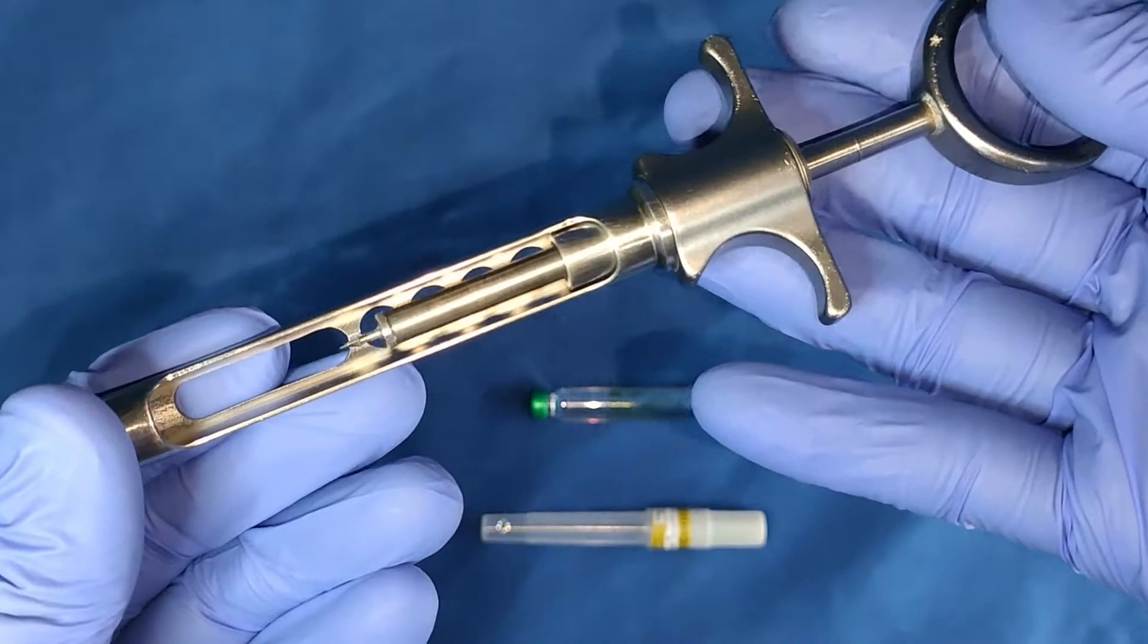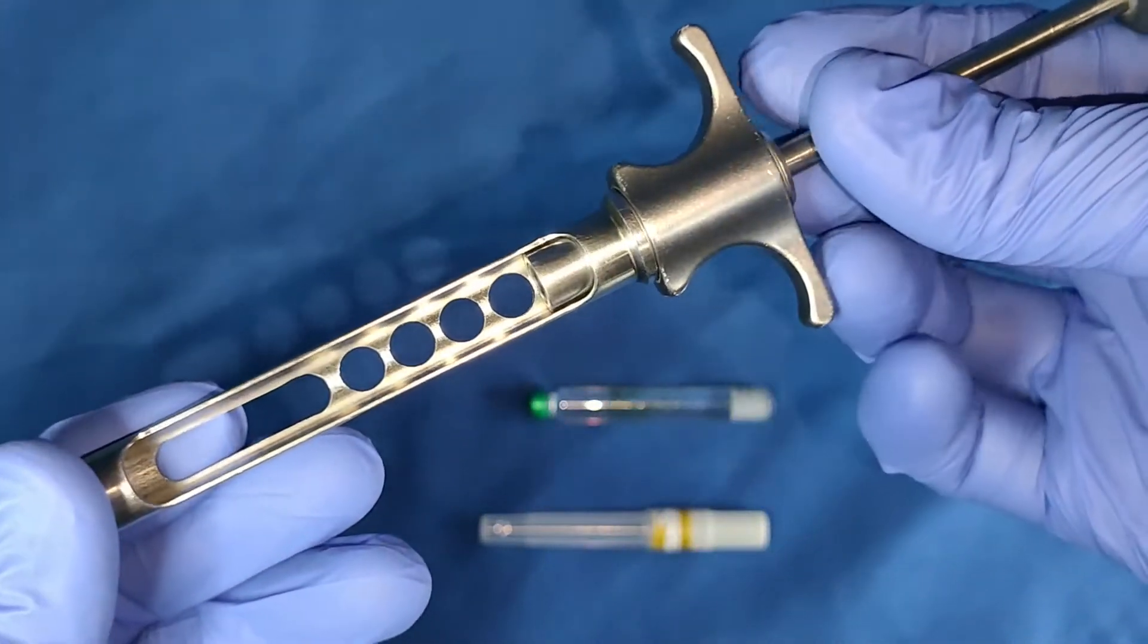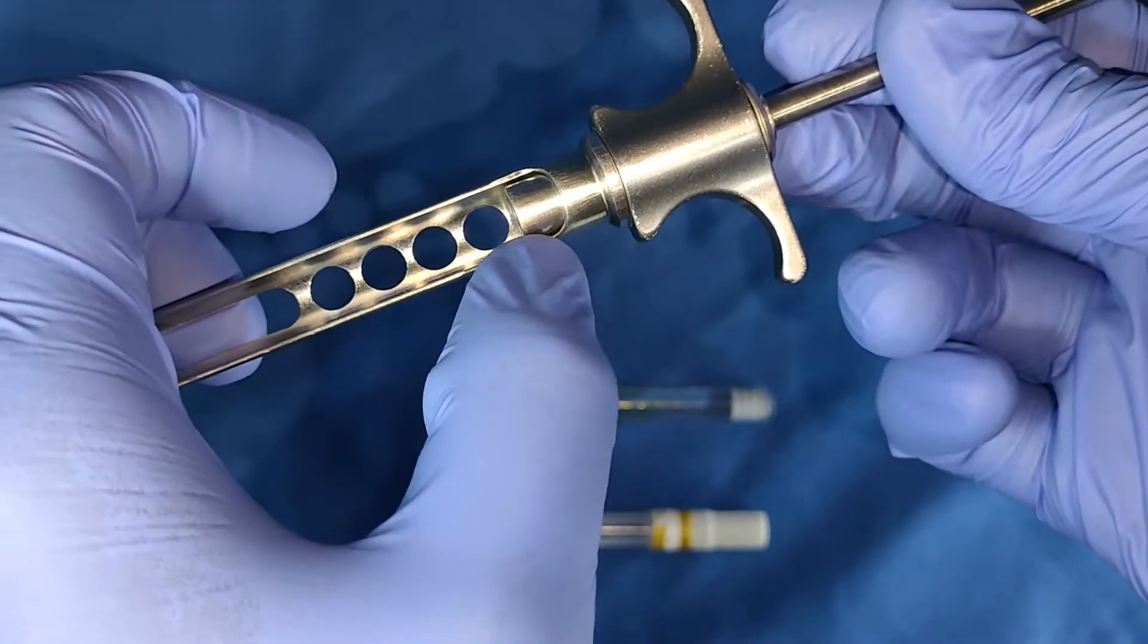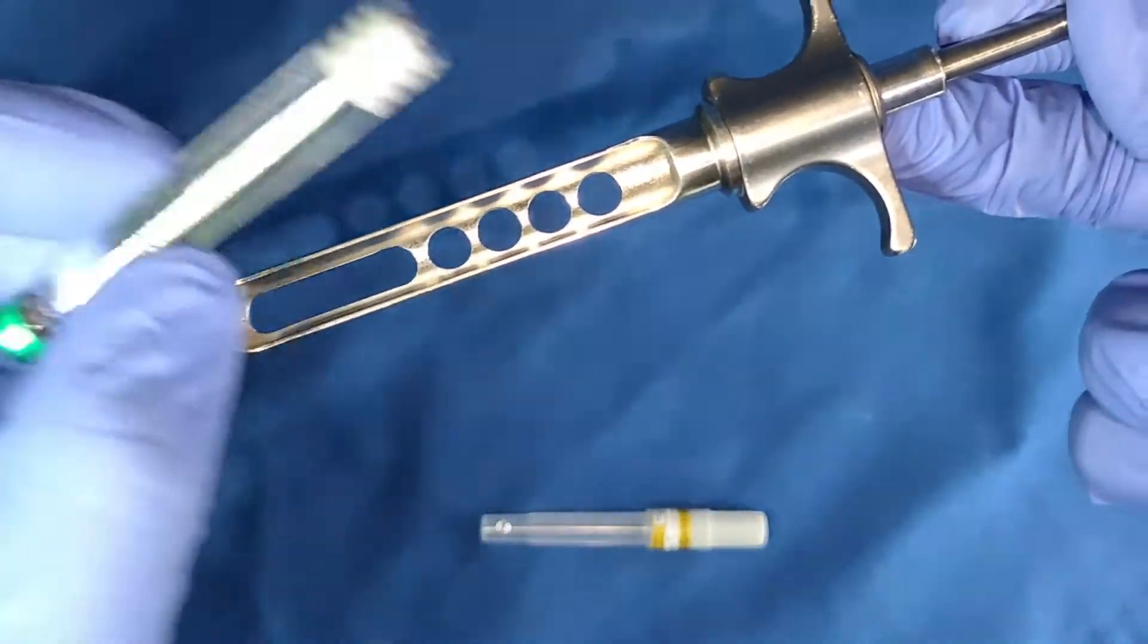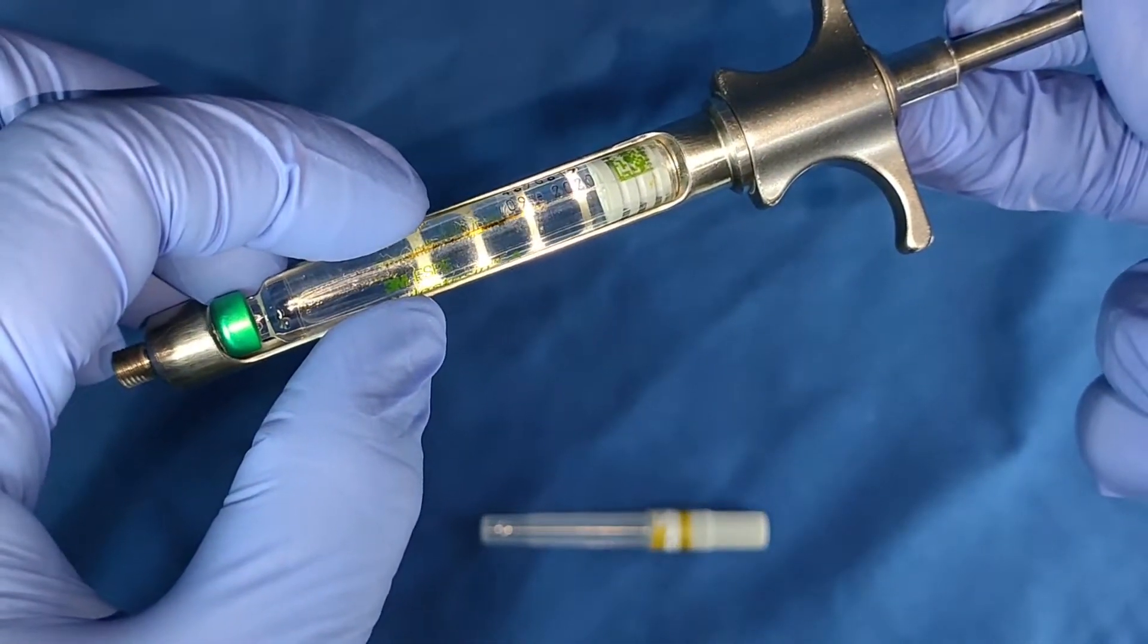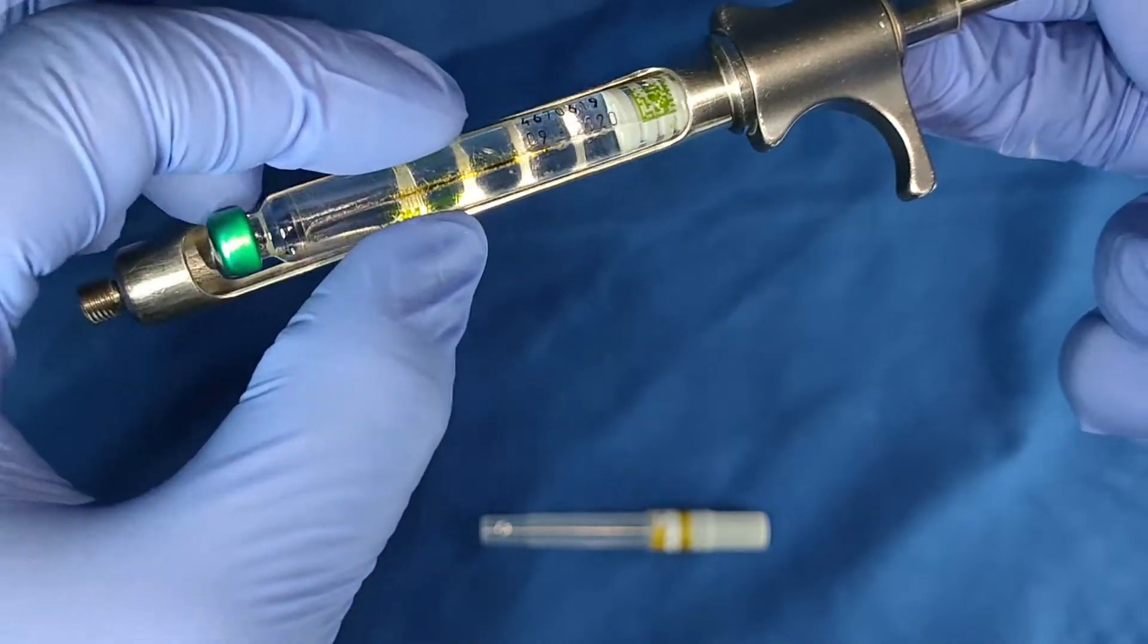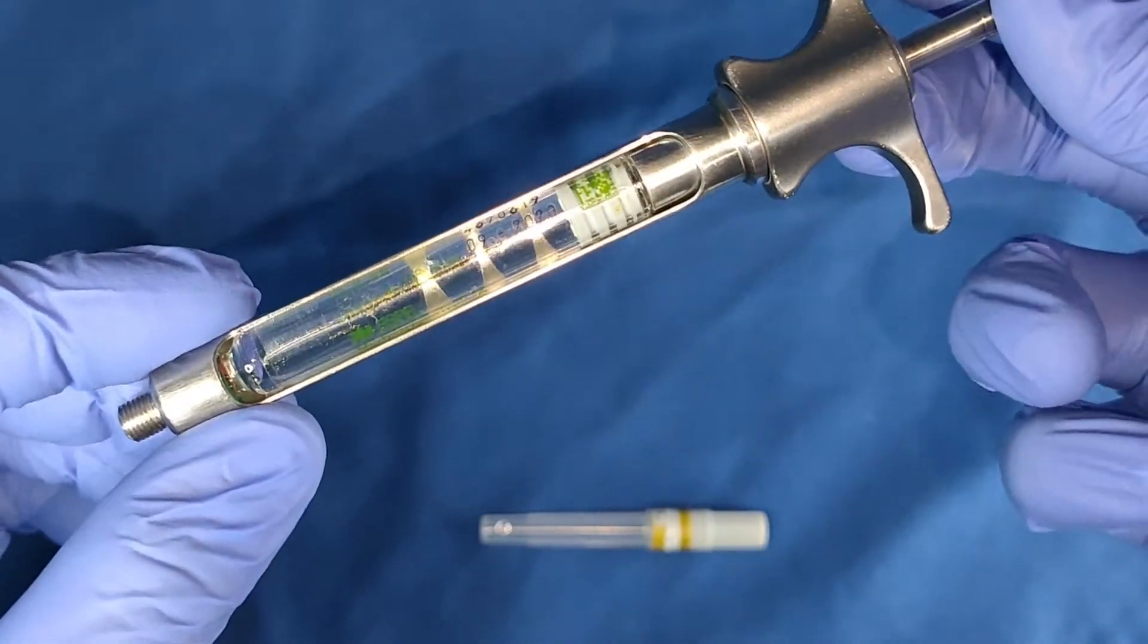First, pull the piston, this part, pull all the way. See, look at this part, pull all the way. And then place the rubber stopper first, not the other way around. This part first, and then release.